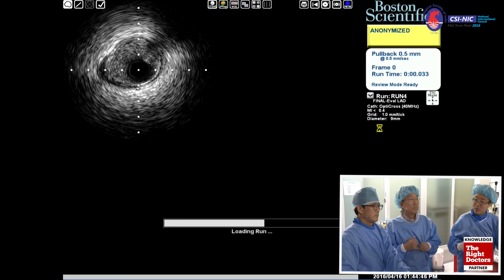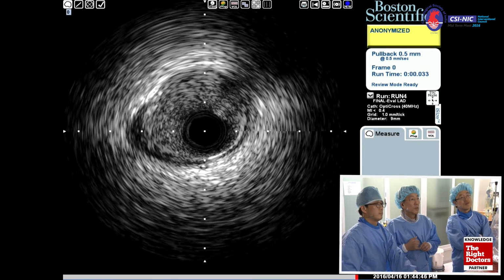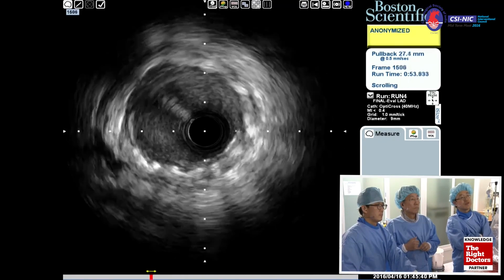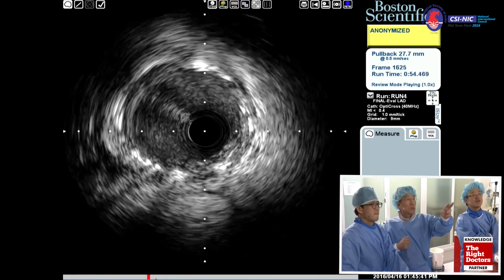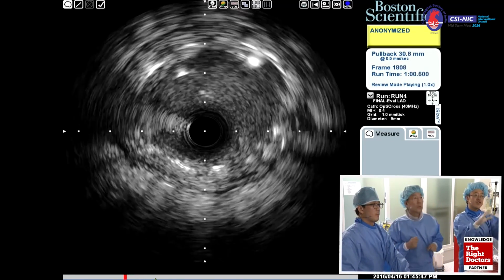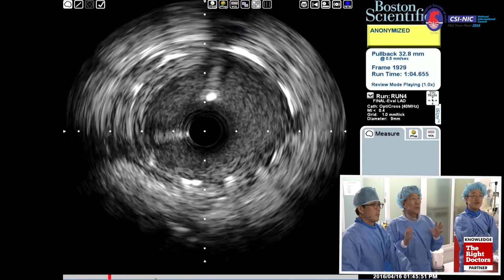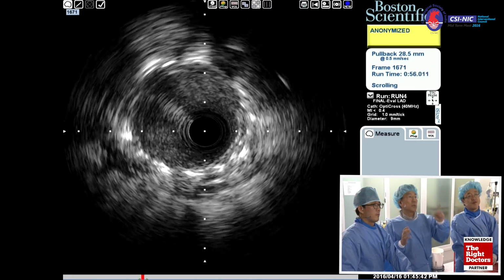Please show only the junction area. Good. Okay, start. And LAD here? Yes, sir. All right, look at that one. Stent diameter is almost 4. This is a cross-sectional area at the junction. Okay, great.